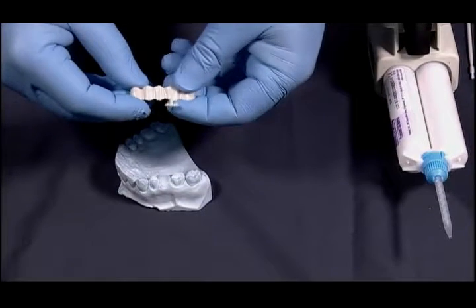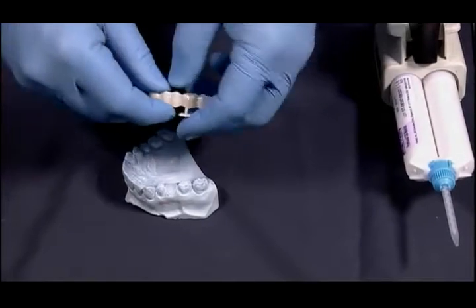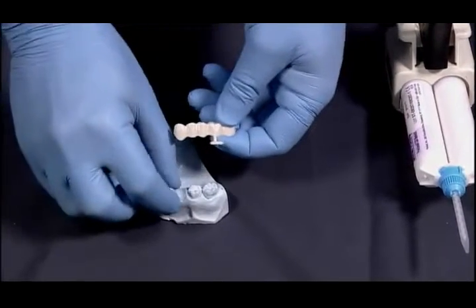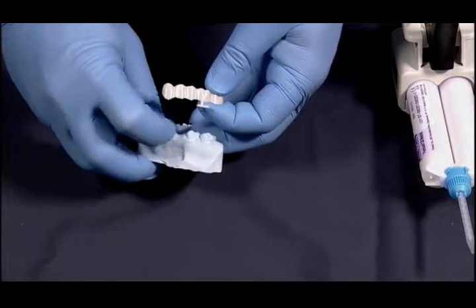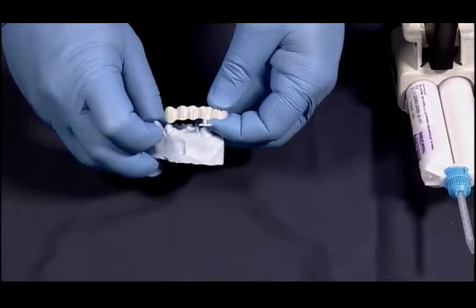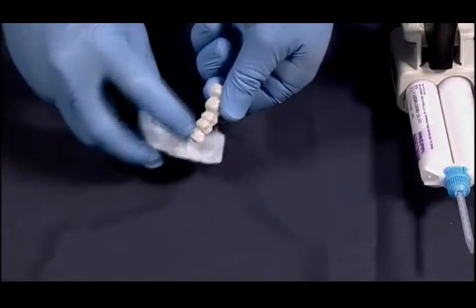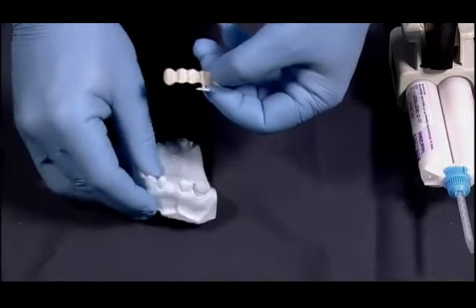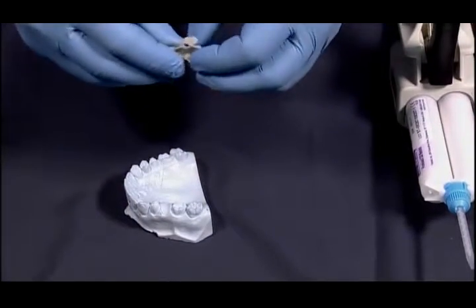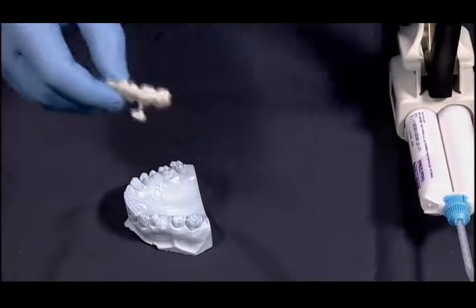I'd be using it chairside probably with a high-speed drill and trimming it to get it to shape. You'll see that the walls of these particular preparations are fairly short, so I'm going to have to do a little trimming of the buccal and lingual walls of this temporary shell form. And then when I come back, we will go ahead and try in the shell form.